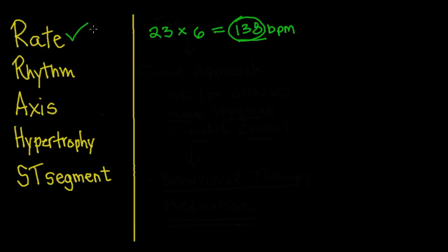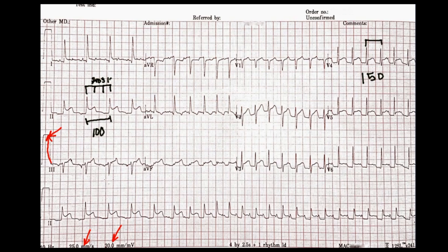Let's look at rhythm next. For rhythm, we're looking at P waves and QRS complexes, and how regular things are. At the beginning, things are generally pretty regular. Whereas at the end, we've got some irregularity — the distance between beats here is a little different than the distance between beats here. There seems to be a speeding up.